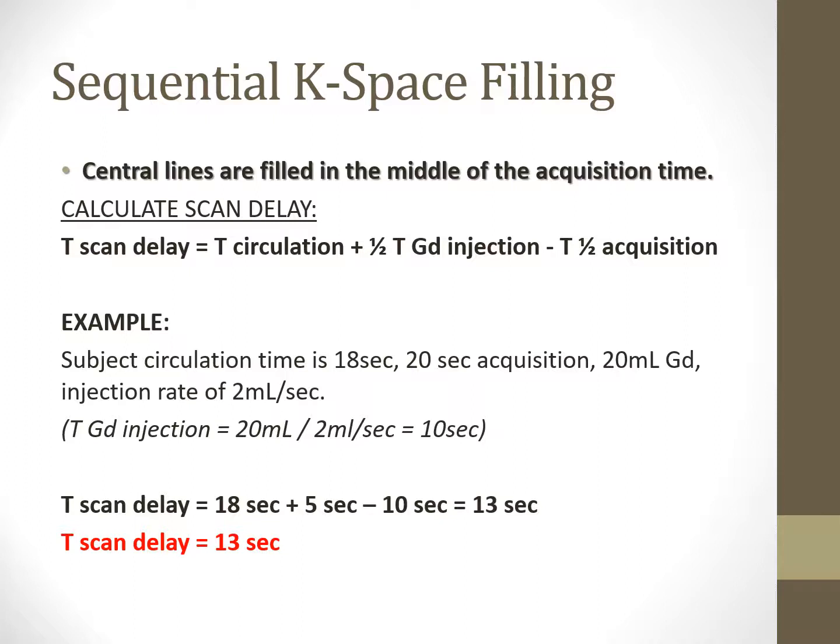This is going to help us avoid that ringing artifact. I said timing was important, so this will help to minimize that particular artifact.